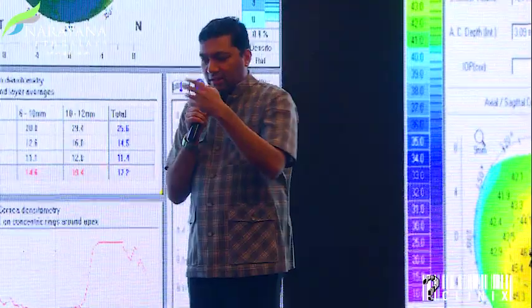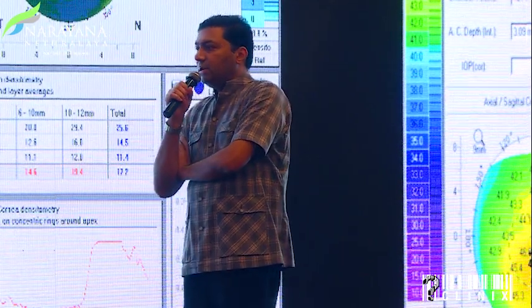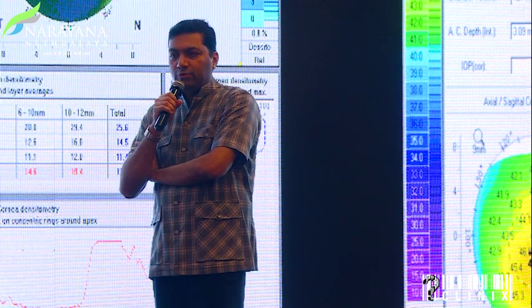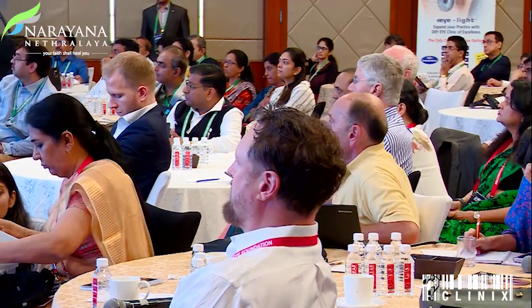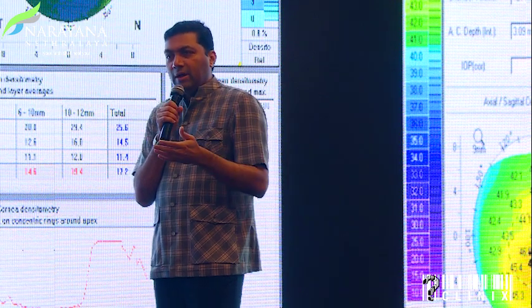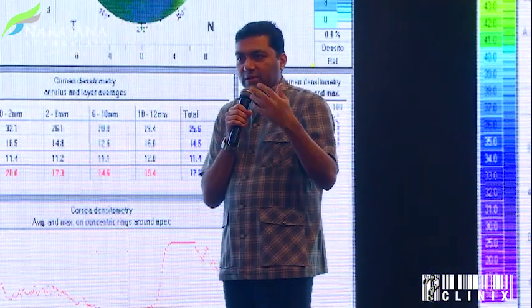And one of the things, Gairik is not here. He did very good work collecting lots of data, maybe a few thousand eyes over time, on the progression. And the work is still on. We built an AI on those patients with multiple parameters. What's very interesting is, I don't have the data yet because it's still building.